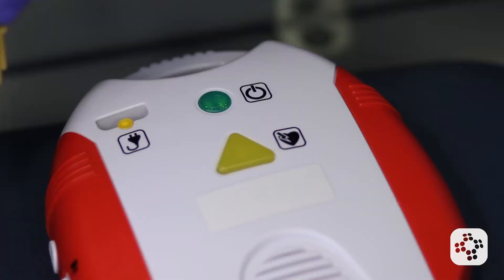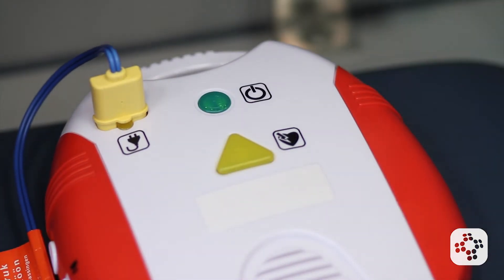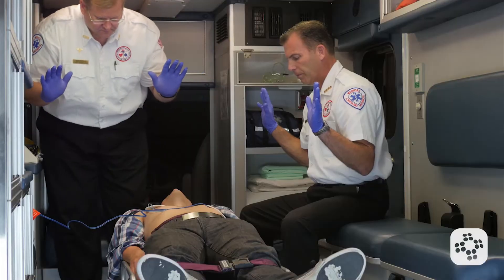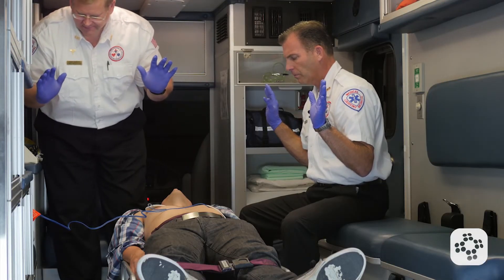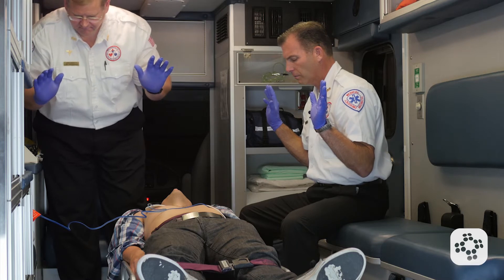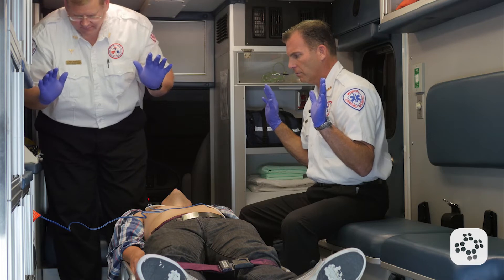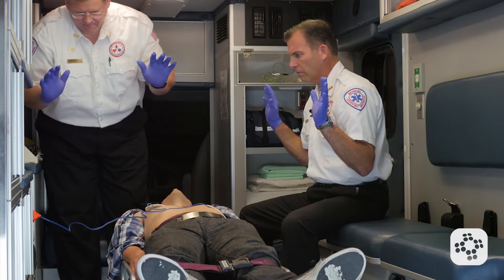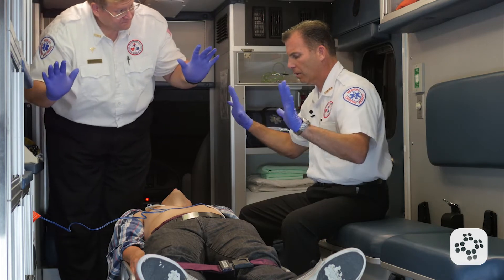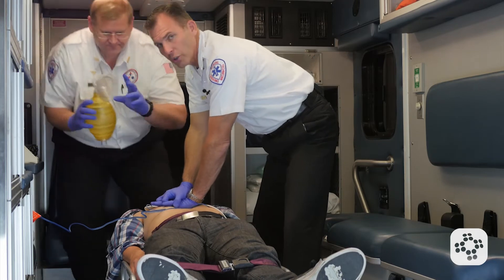Check connector and pads. Analyzing rhythm — everyone stand clear. Shock advised. Charging. Everyone stand clear. Push the shock button. Clear. Shock delivered. Back onto the compressions right away.